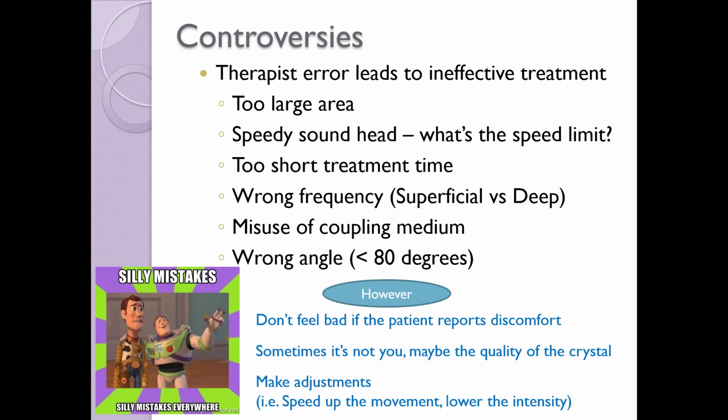Sometimes we are limited by the technology we have available to us. We need to make adjustments such as speeding up the movement or lowering the intensity, which ideally would result in a greater treatment time to make the patient more comfortable during the treatment.